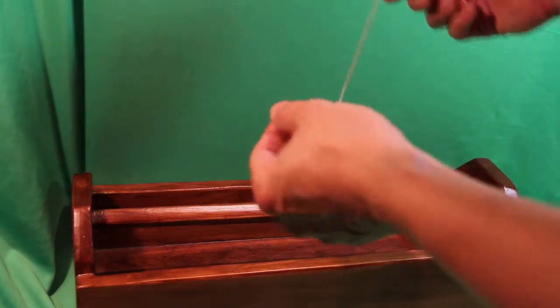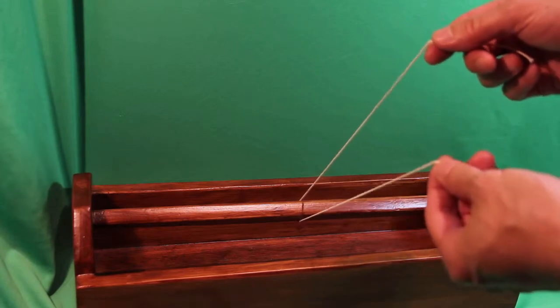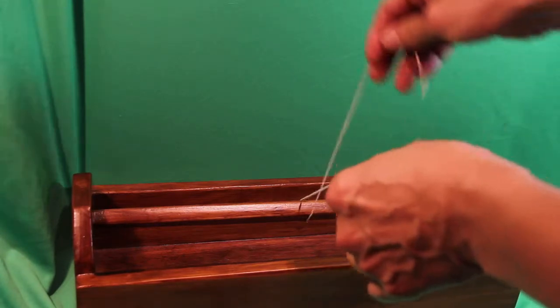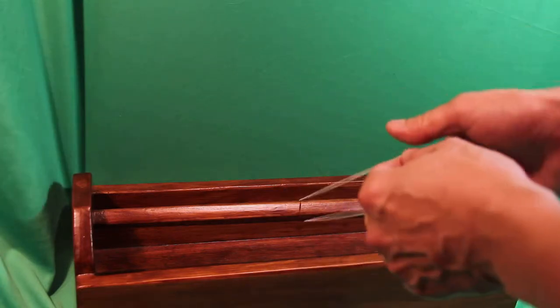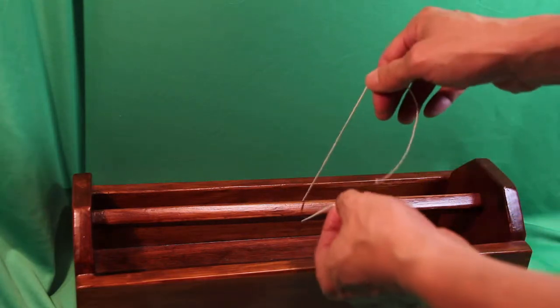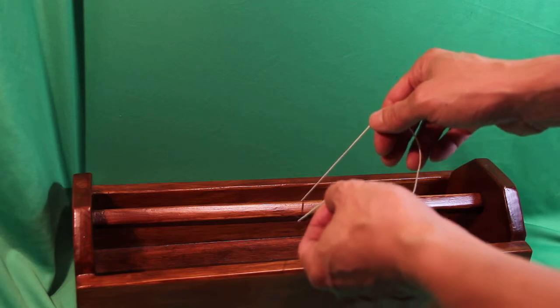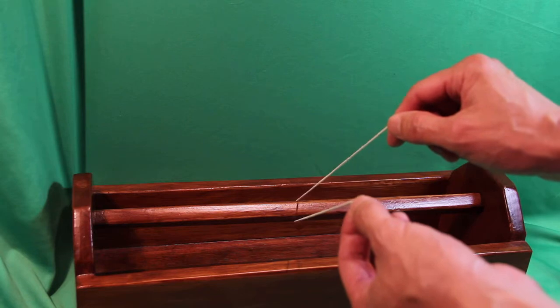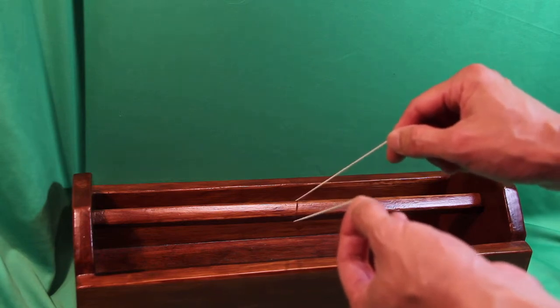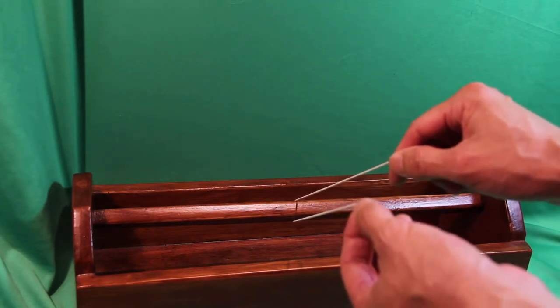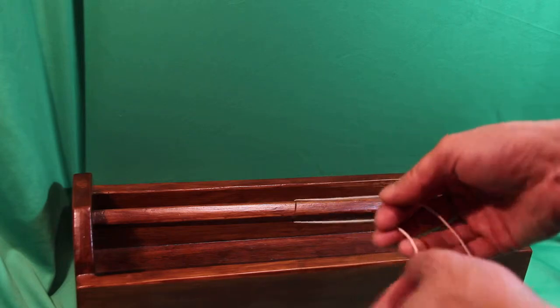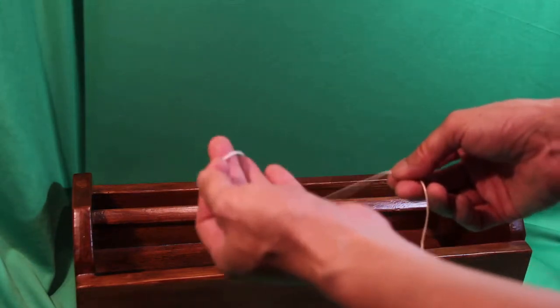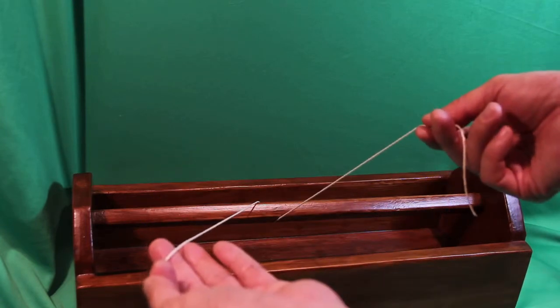First of all, you have to understand right off the bat that one must cross the sutures to start with. Because if you don't cross it to start with, it's hard to get the first throw of your square knot down. It's hard to get it down to make it flat. I'll demonstrate later. But here, always understand that you start with the two strands crossed.